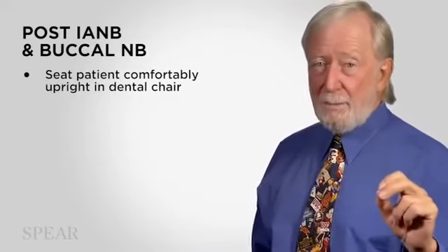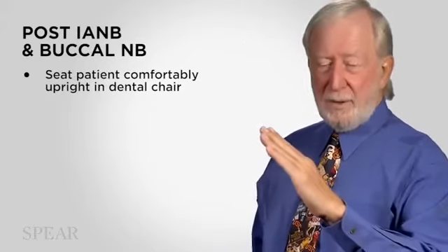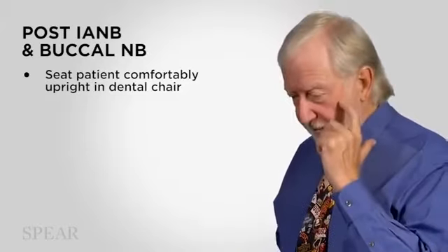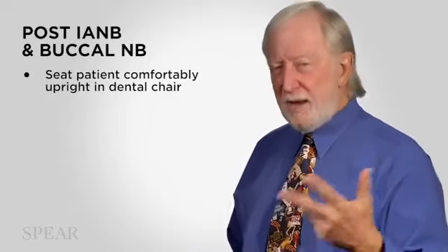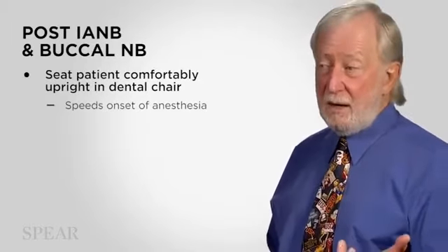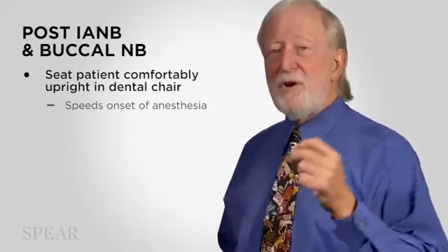So once these injections are done, the IA block and the buccal injection, sit the patient up comfortably. And what I have found in my experience, I can't give you a scientific reason for this, but when I get called down to that clinic at USC and the patient has gotten 2 or 3 injections from the student, 2 or 3 from the faculty member, and it's always the mandible, if that patient is still lying down, as they almost always are, I simply sit them up. I sit them up comfortably. I walk away for 5 or 10 minutes and I come back. And invariably, they're number. They may still not be numb enough for treatment, but they're number.